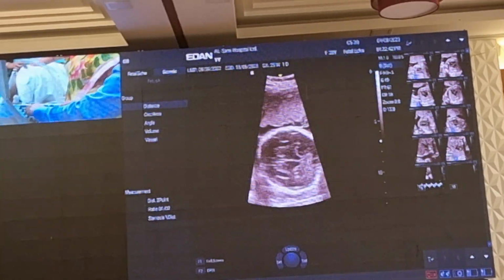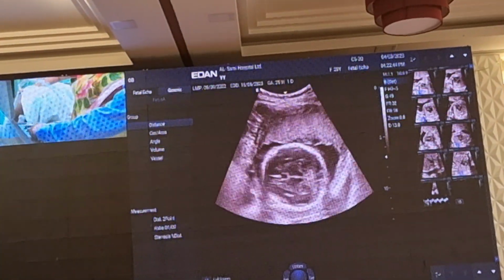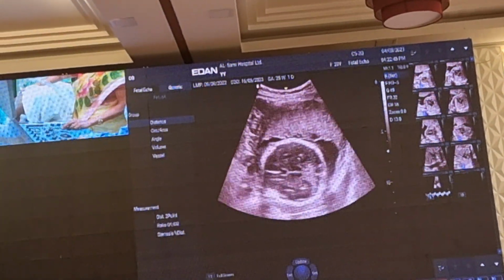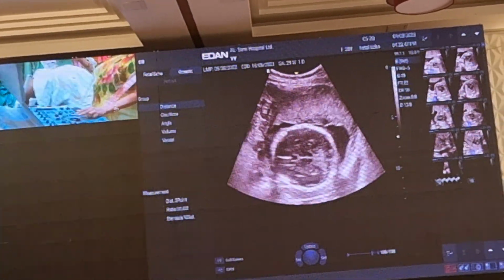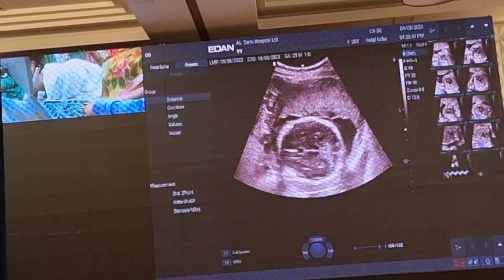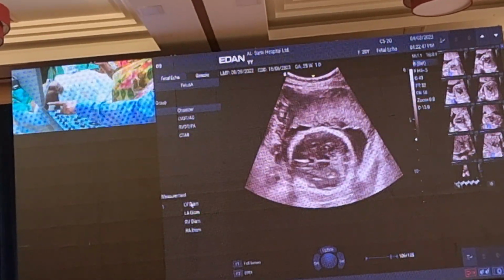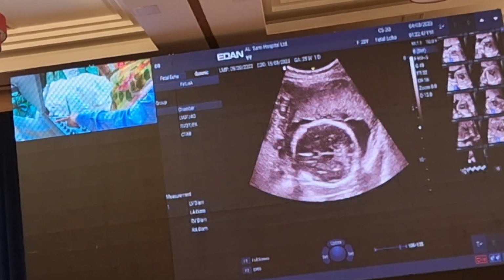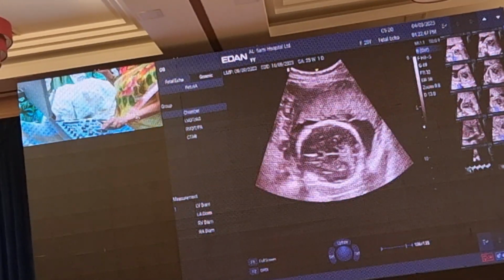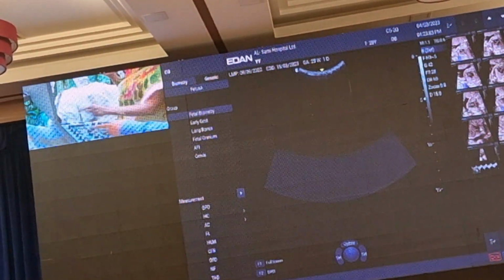Yeah. Go out of it, no more. Okay. Show them the three basic measurements. So, biometrics. Yes. So please go on.